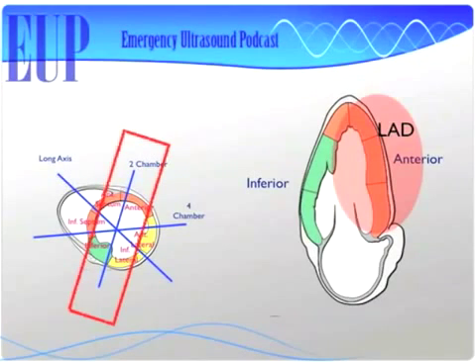Unfortunately, it's not green on the ultrasound machine itself. It'd be nice if the walls had colors on them on the ultrasound machine. That'd be awesome.